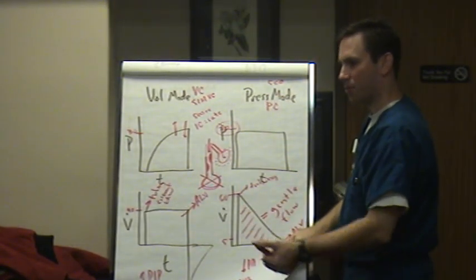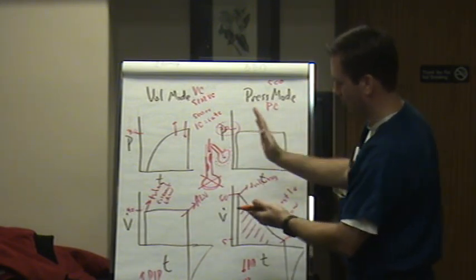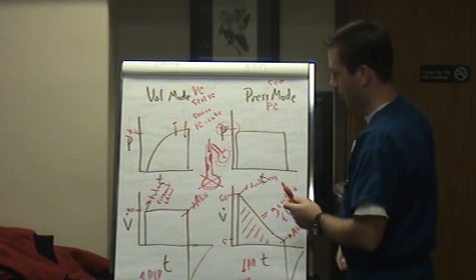But PRVC, tell me what's nice about it. What is PRVC good for? What's a nice thing about PRVC when you look at both sides of this chart? Gives you a controlled volume. Good, you definitely get that?